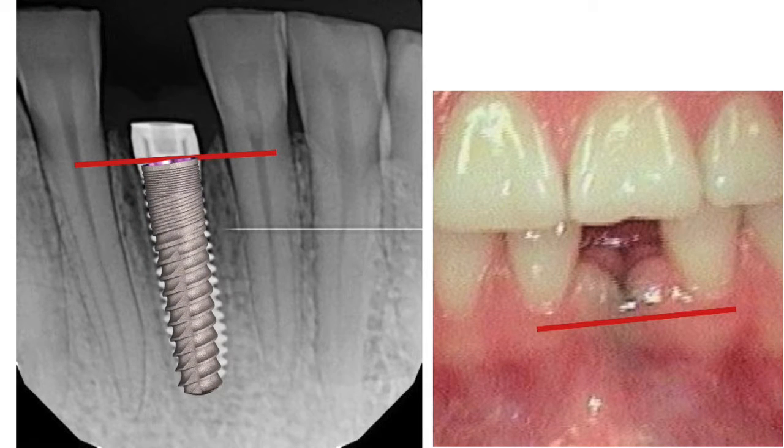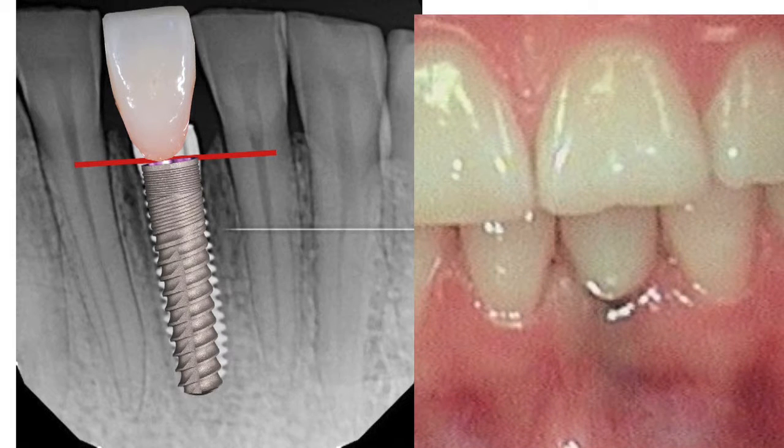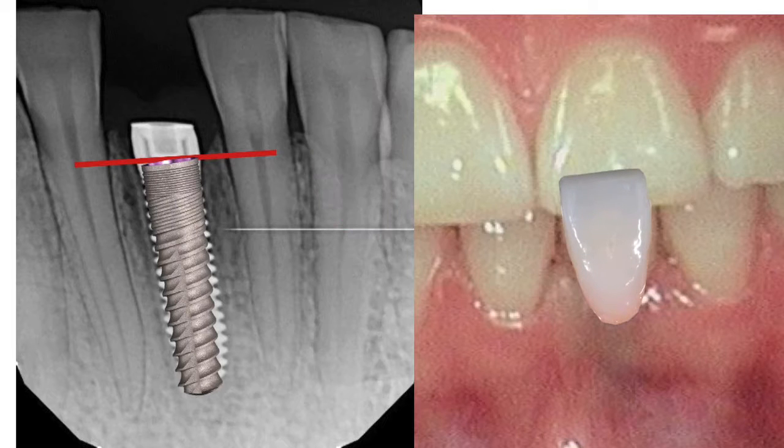You can see the x-ray shows they placed the implant so high at the height of the contour of the adjacent teeth. You want to drop it down about 3 millimeters below the zenith of adjacent teeth in order to get this running room for the abutment. So this is what the adjacent teeth, where it should have been, right about there. That would give them a nice running room for a good crown on top of that. So rather than here, that down there. So we made it look a lot better. In this case, you probably still have some dehiscence. You have that graying there. Probably have some dehiscence on that implant, but it would have been in a better location to begin with.